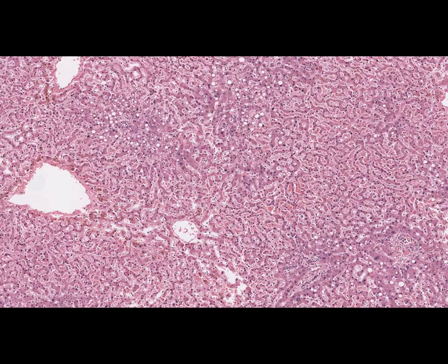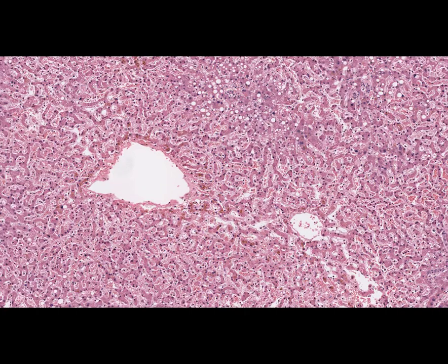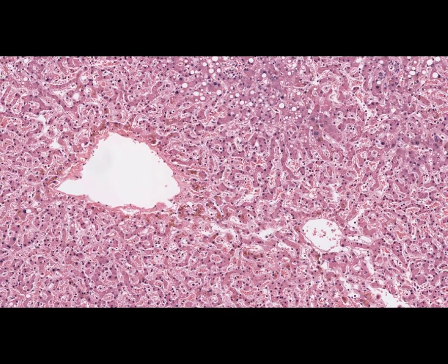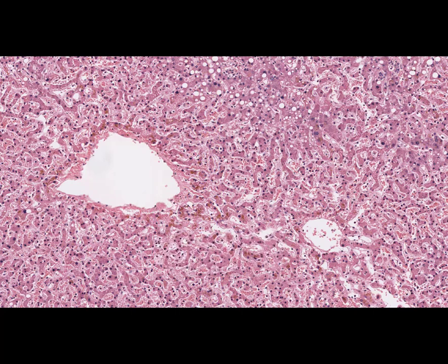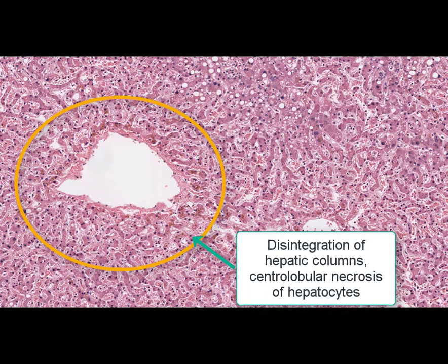At high magnification, the following changes can be observed. Firstly, we can see dilation of the central veins of the hepatic lobules, as well as congestion of the vessels of the microcirculatory bed. So sinusoid capillaries look congested and full-blooded. There are pronounced necrobiotic changes of hepatocytes in central lobular zones of the hepatic lobules, means central lobular necrosis, along with focal hemorrhages and accumulation of hemosiderin.